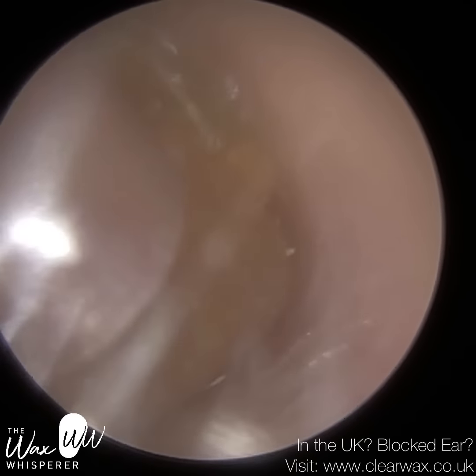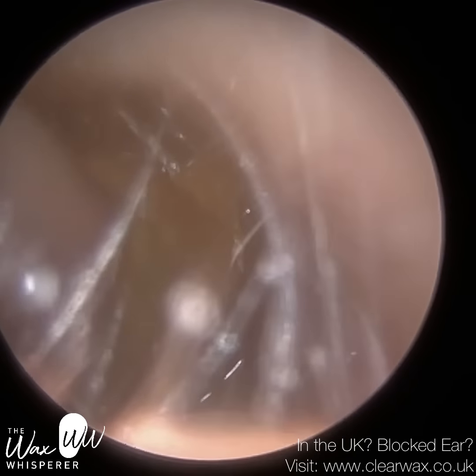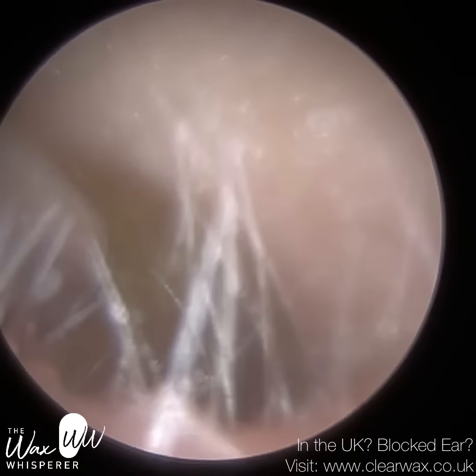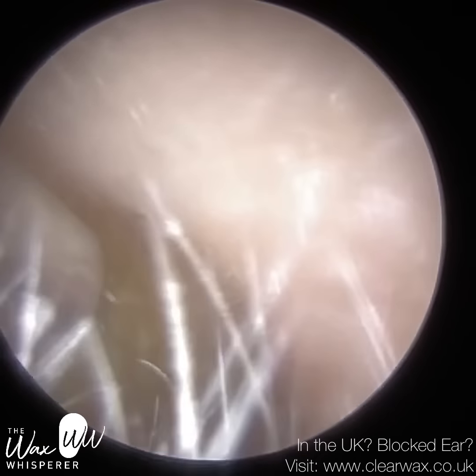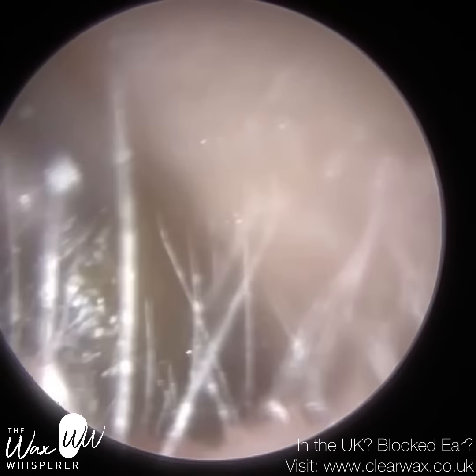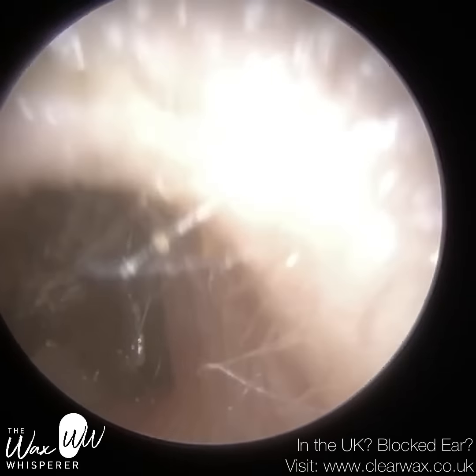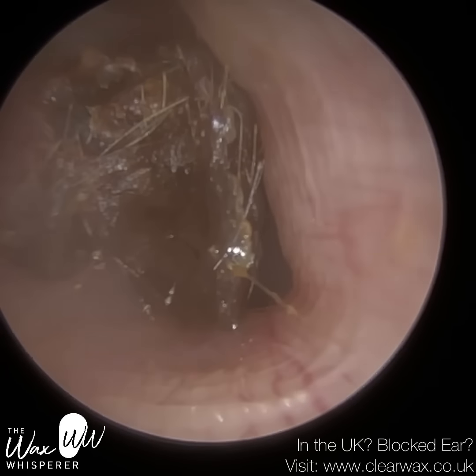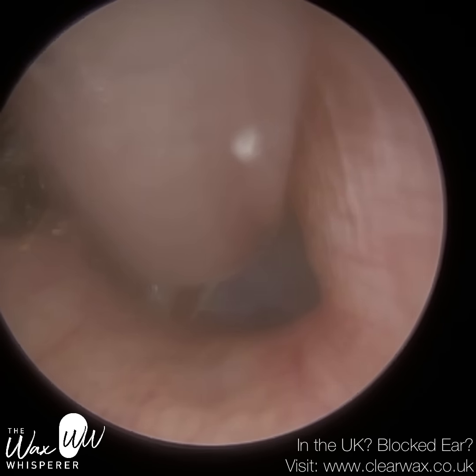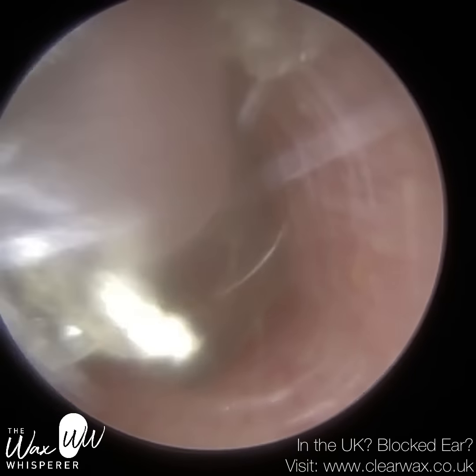Now, you'll see if you continue to watch the entire video, you'll see the last part of the ear canal, the deep part, the medial part. There's a protrusion of the front part of the ear canal, the anterior canal wall, and behind that protrusion, the wax was trapped, which made it really difficult to remove. And it's a bit more crusty and dry. It's a bit more rough in consistency as well. You can see there's a few hairs matted there, and that can be uncomfortable sometimes when we extract for the patient, because the surface of the wax rubs against the canal wall, and when it does, it can sometimes just be slightly uncomfortable for the patient.